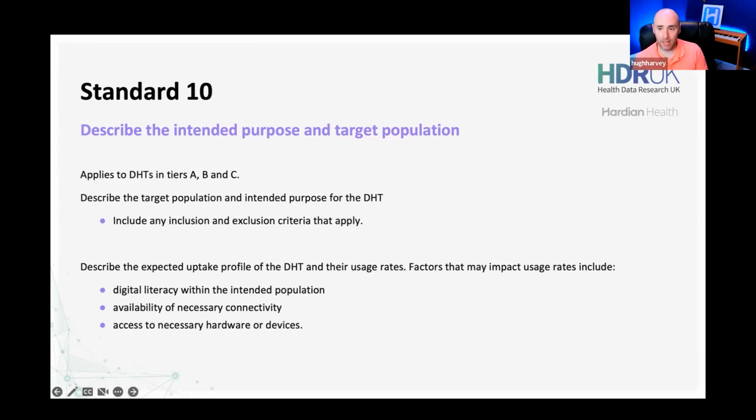And if your software actually interacts with hardware or another type of device, you have to obviously think about access to those devices and maintaining that access. And then there's also cybersecurity considerations about how you make sure that the data that is flowing between that hardware device and your software device is cyber secure and compliant with GDPR as well. So the standard covers all of those considerations, which would also be covered by your intended use, including exclusions for use.